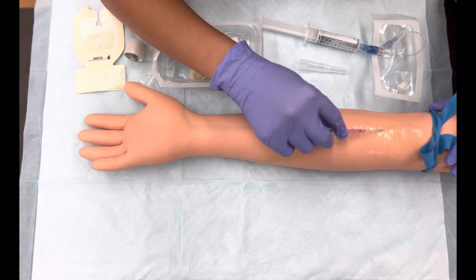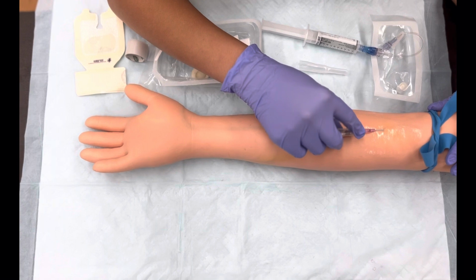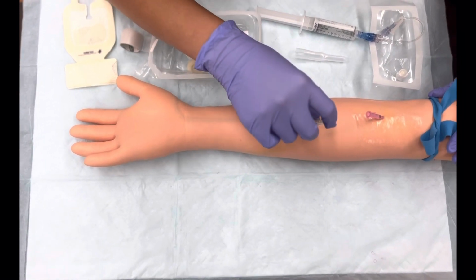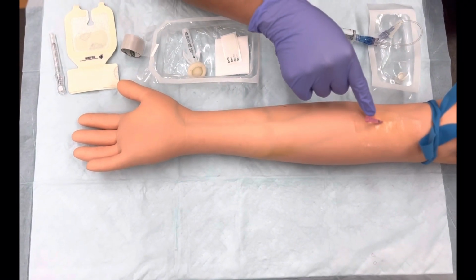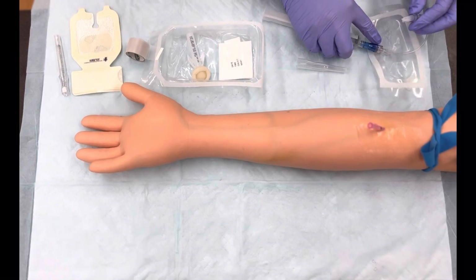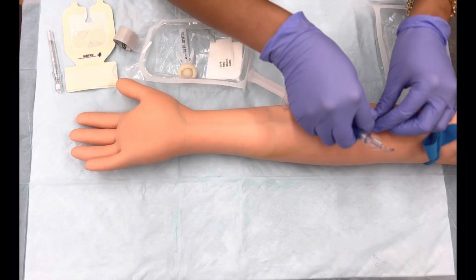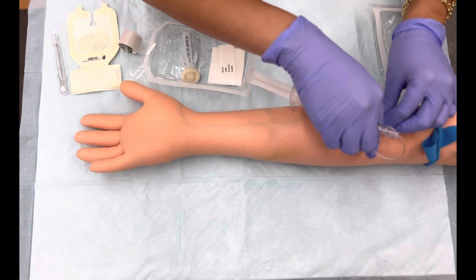Observe for blood return through the flashback chamber. Lower and advance the catheter appropriately, loosening the stylet over the needle catheter. Hold the skin taut while stabilizing the needle and advancing the catheter off the needle. Thread the catheter into the vein properly. Next, connect the primed extension to the IV catheter.